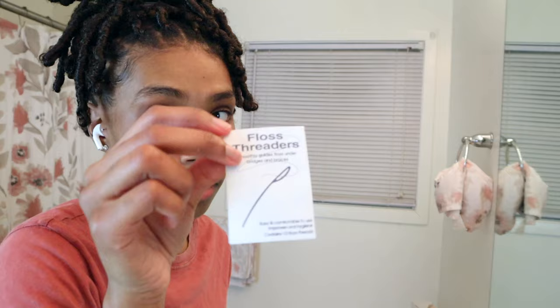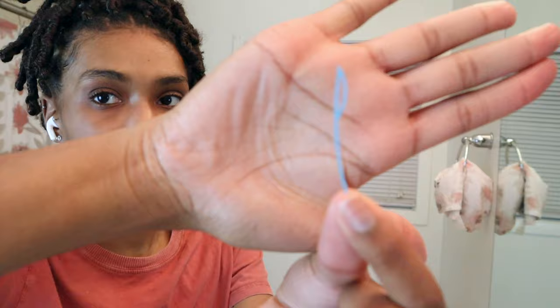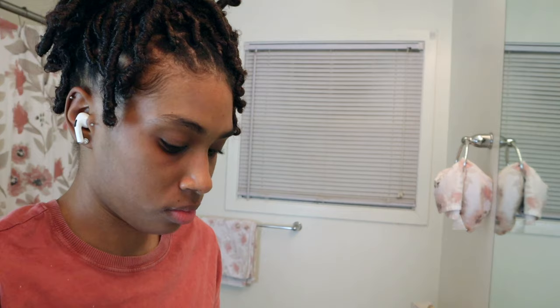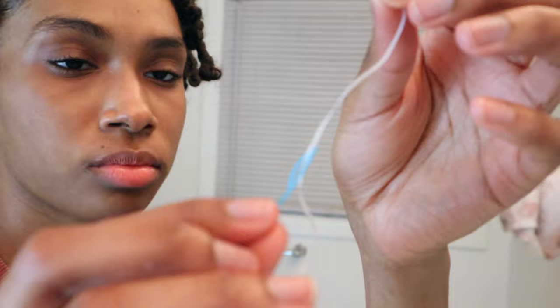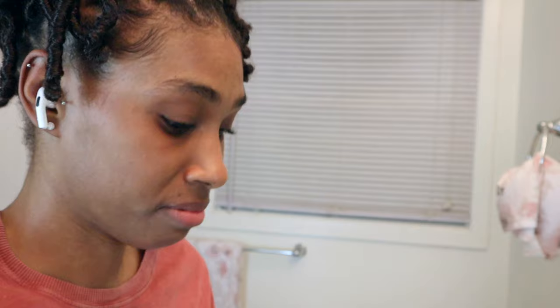Here are the floss threaders I was telling you about. I used these for the first two weeks that I had my braces, and after seeing how annoying it was I stopped using them altogether. But I will show you how to use them. I feel like it's just way easier to use regular floss, but to each their own — however you feel most comfortable. Here's how you thread it through like a needle and thread, then take it and put it through in between the wire and pull it through. It just takes too long to keep threading it through, which is why I don't do it.